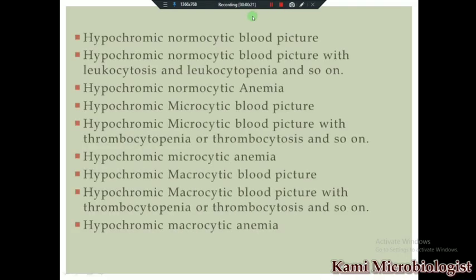Today in this video lecture we are going to talk about some other blood smear comments. In the previous video lecture we talked about normochromic related comments. In this video lecture we are going to see the hypochromic related comments.